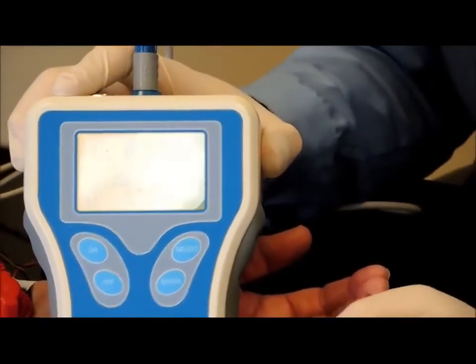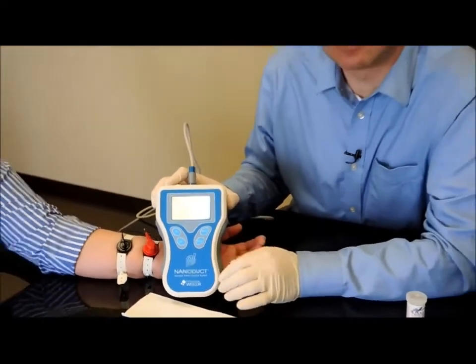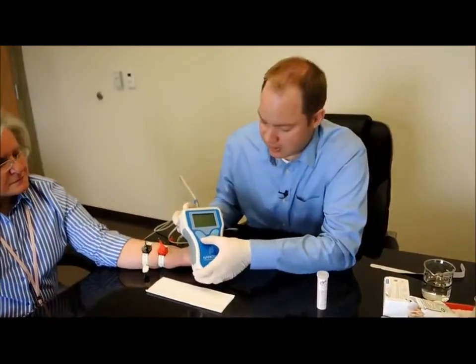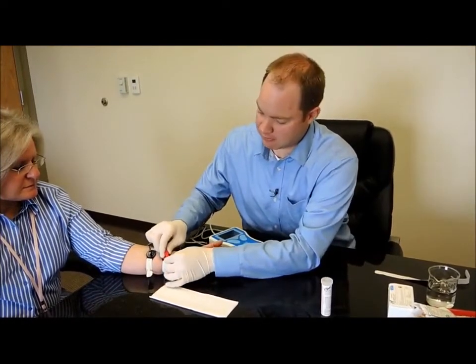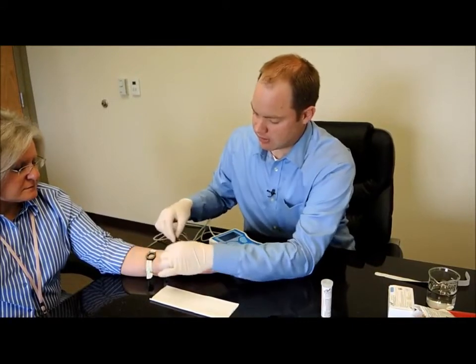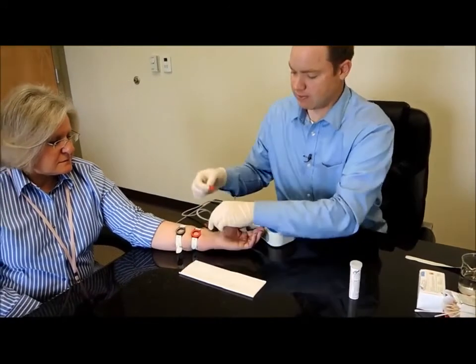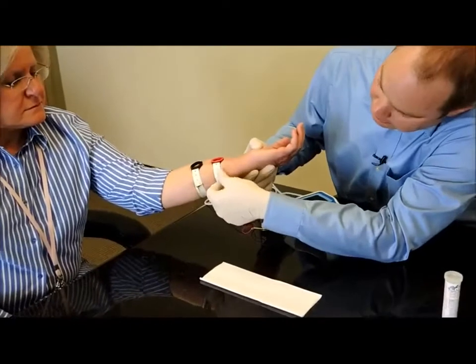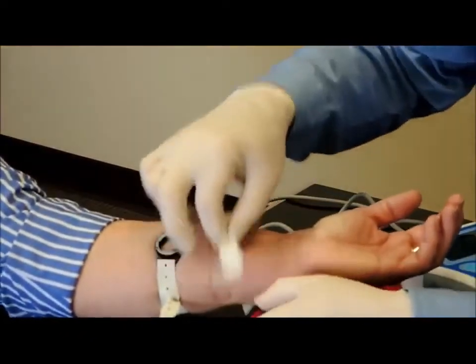So at this point the sweat test is complete and we can disconnect the cables and the electrodes from the patient. So if I want, I can turn off the Nanoduct and just disconnect everything from the patient. Normally just untwist the rings on the holders, take everything out, take the straps off by again just popping it off of that post.